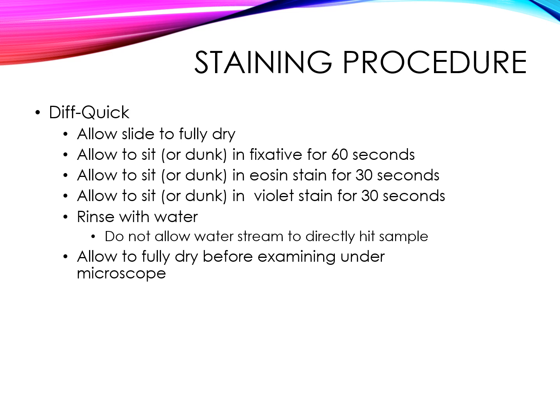But that's just me. And then once you blot off, you're going to rinse the blood smear, and you're going to make sure that you don't rinse directly over the actual smear. So just under the feathered edge and the back of the slide, you're going to rinse with water, and then you're going to prop it up somewhere, either against the wall or backsplash, or in a slide drying rack, and let it completely dry before you look at it under the microscope.